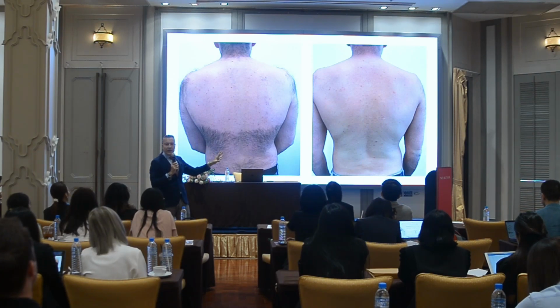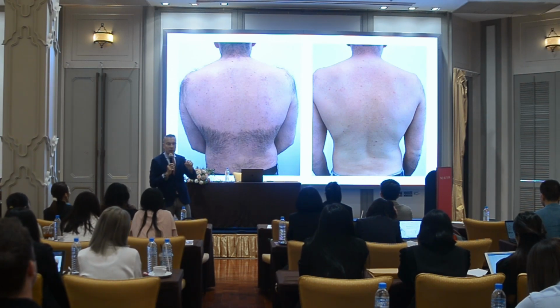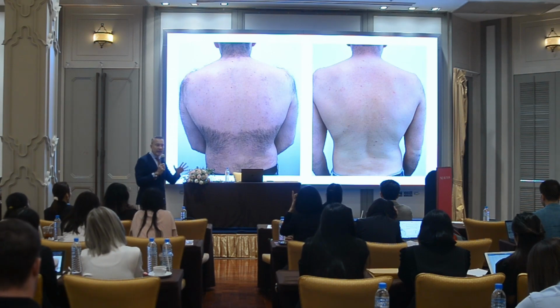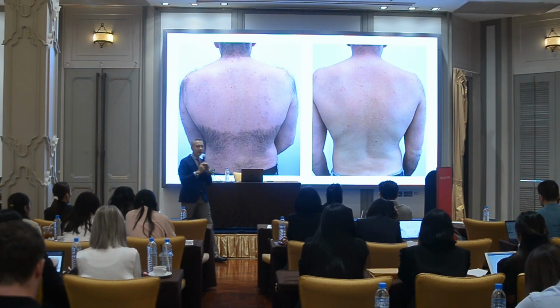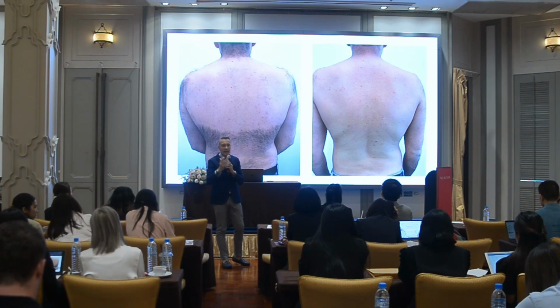So when you have this kind of skin, this kind of hair, it is the best for a laser because you have a very good difference between the color of the skin and the color of the hair. No matter if you go paint mode or stamp mode, you get always the same results. Maybe one treatment more, one treatment less, but it's not that you have 4 sessions in stamp mode and 12 sessions in paint mode.